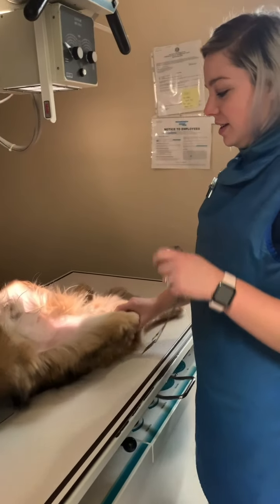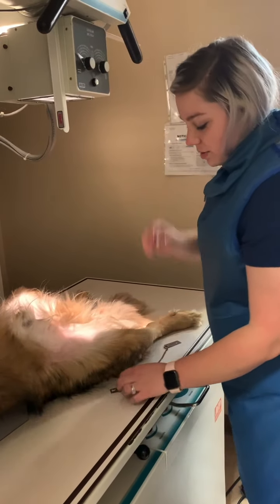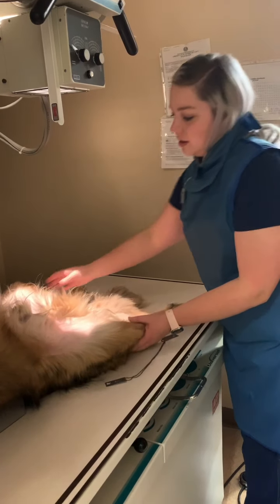We have him slightly positioned. We're going to put our marker, make sure our collimation is there.